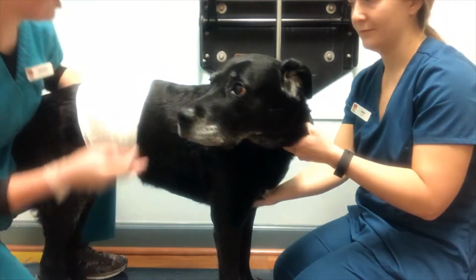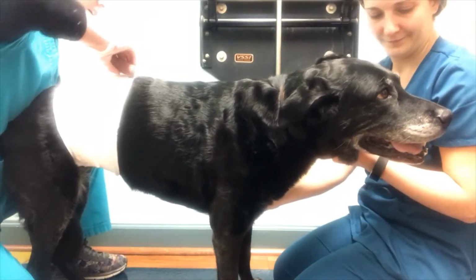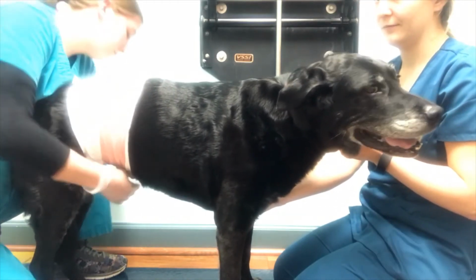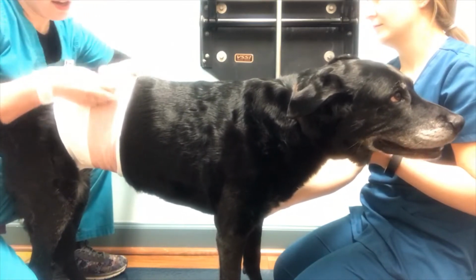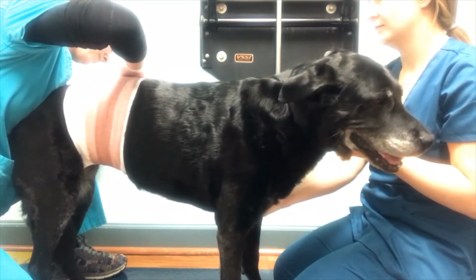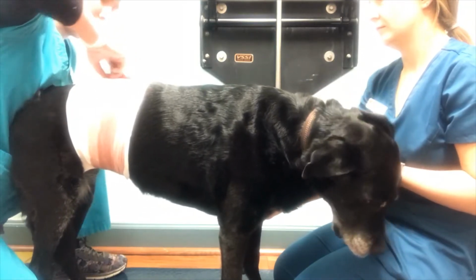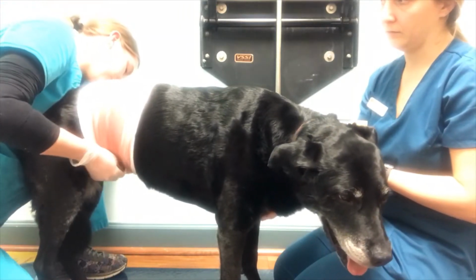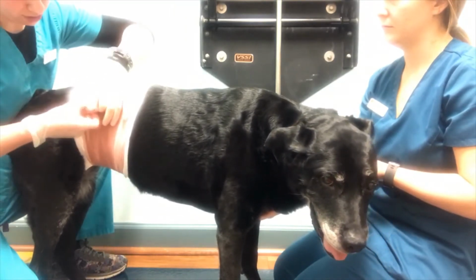Now I'll use my roll gauze here and place another layer. There again, I'll pull it snug to apply even pressure through the abdomen. 50% overlap again. And I'm making sure that there's a small strip of cast padding between my more constricting layers and the skin. That is to prevent constriction from the vet wrap directly onto the skin, so you don't cut off circulation.